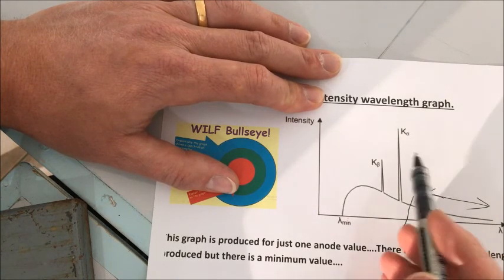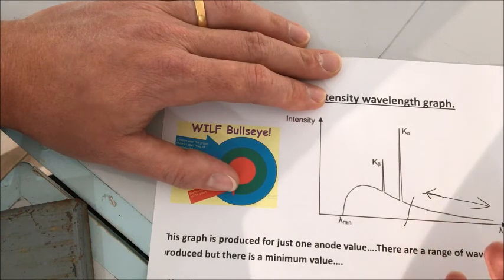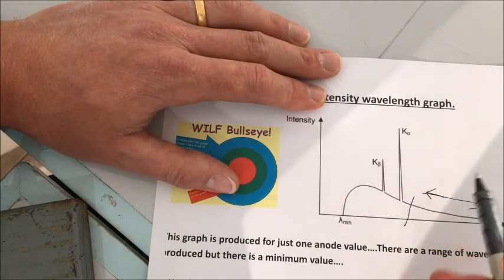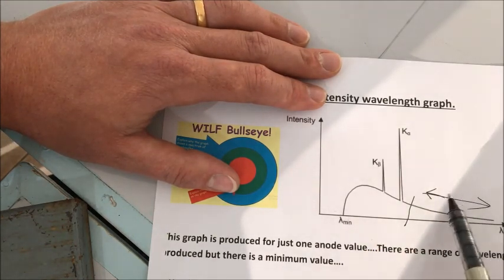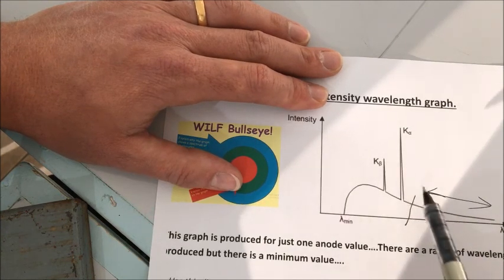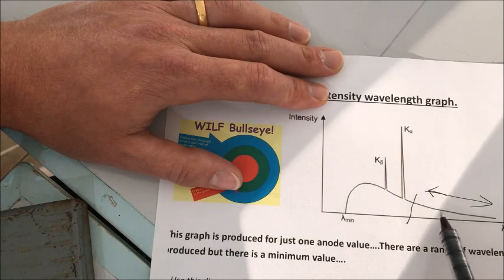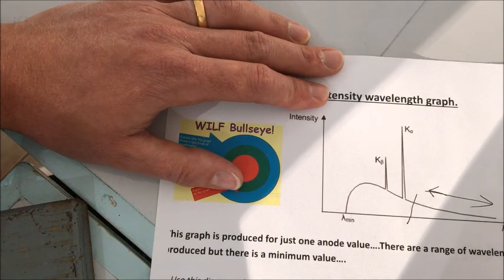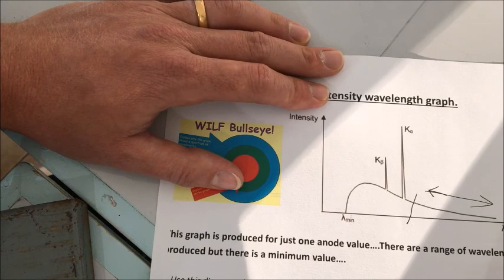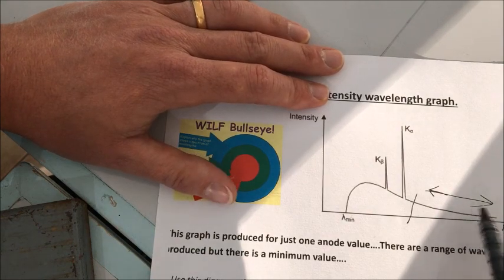So it is necessary to try and filter those out, and that is done with an aluminium grid, that stops the scattering, it stops the photons, and it filters out the softer, longer wavelength, lower frequency rays that are not really doing anything that is useful, even on the kidney one. When the kidney one is produced, it's probably got the anode voltage adjusted so that the majority is right here, and it's exactly as they want it, but there will always be a range somewhere near the end here of longer wavelength ones, which we don't want. They are doing harm to the patient, if anything. So they filter them out with these aluminium grids, this aluminium filter. Okay, so that's improving the experience for the patient.